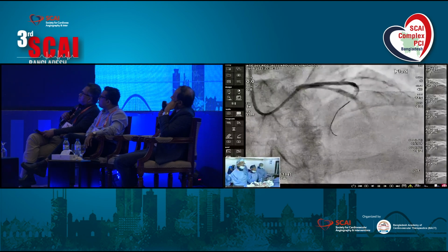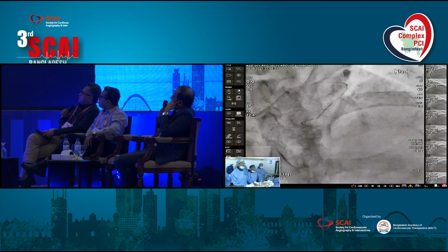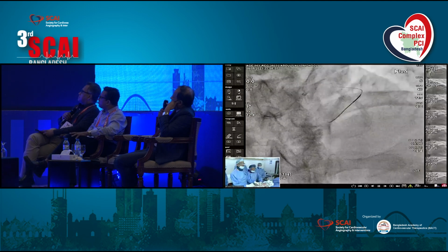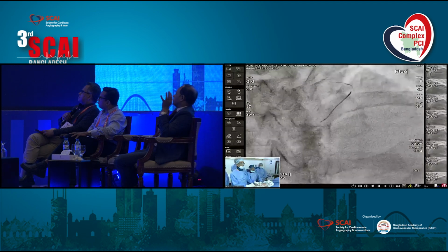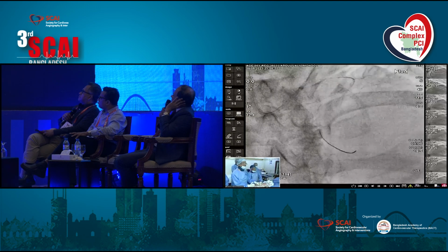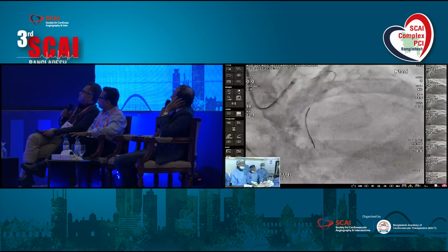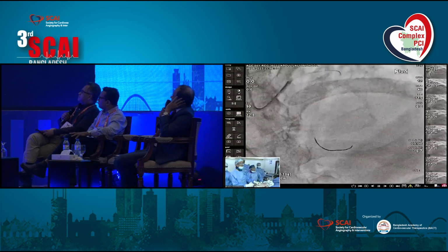So now what is your plan? Go for the fix to the distal LCX? Yes. LCX, this is LPDA. Yes, LPDA. So you don't have any plan to do the right coronary? No, right is non-dominant. Another few minutes. We have time. Our primary target is to treat the LAD in a live case. So I think the LPDA is a big branch.